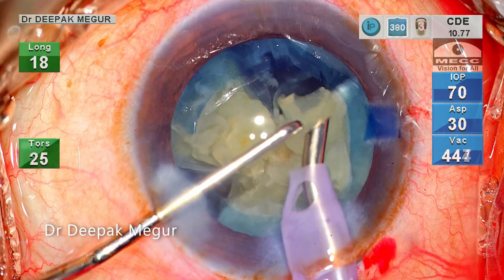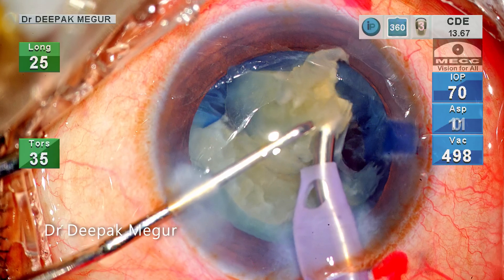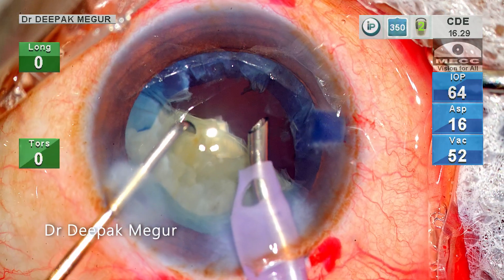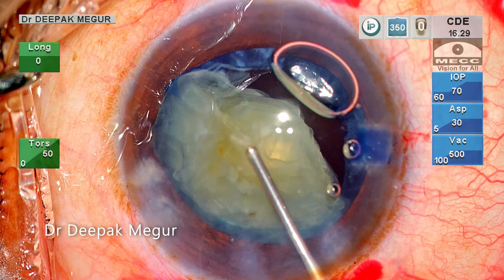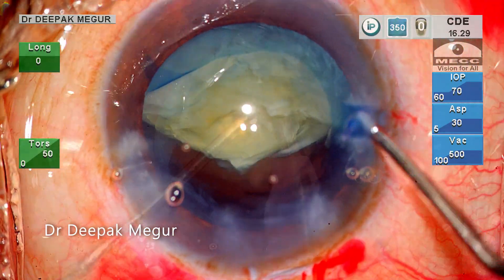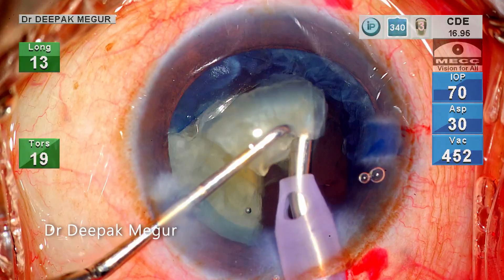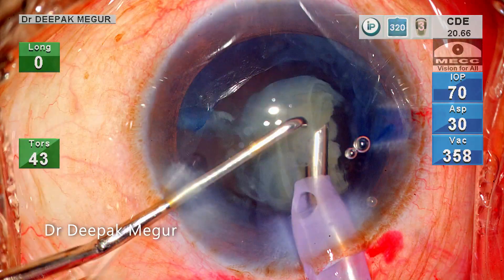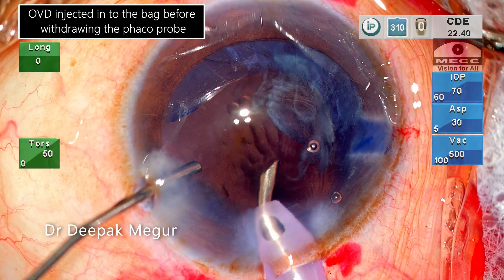These two fragments are being emulsified in a controlled manner. As can be clearly seen, the plane of emulsification is much more anterior than what I would have liked, but the circumstances are such that emulsifying in a much more anterior plane is a safer option. Before coming out, I inject OVD through the side port to prevent any shallowing of the anterior chamber. We want to maintain anterior chamber equilibrium at every step — that's very critical in such situations. The second hemi-nucleus is then divided into smaller fragments and each is emulsified in a controlled manner. OVD is again injected through the side port before coming out.